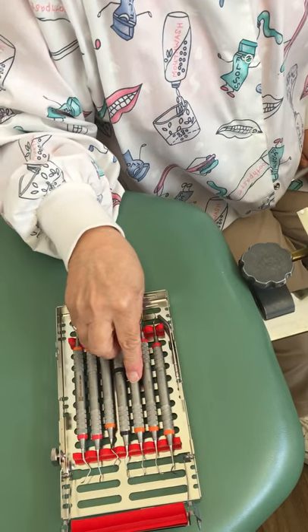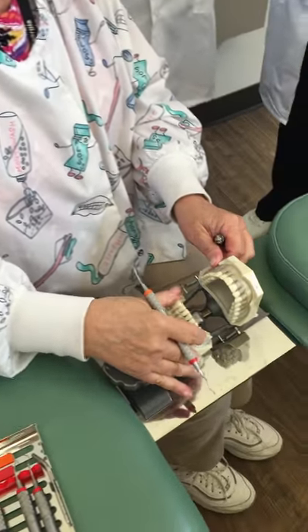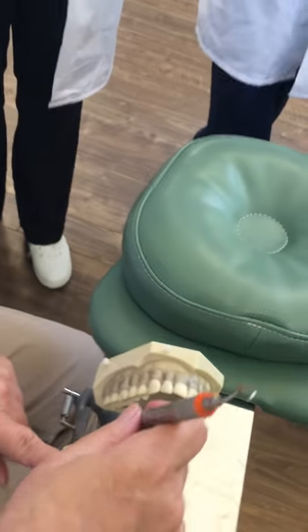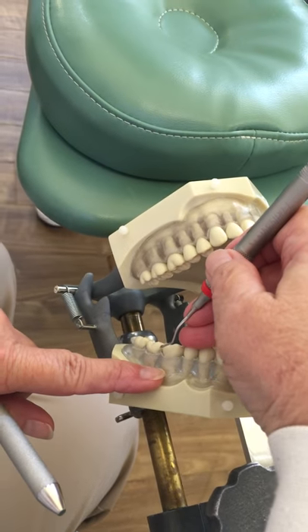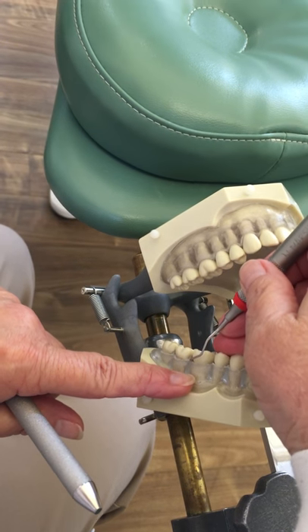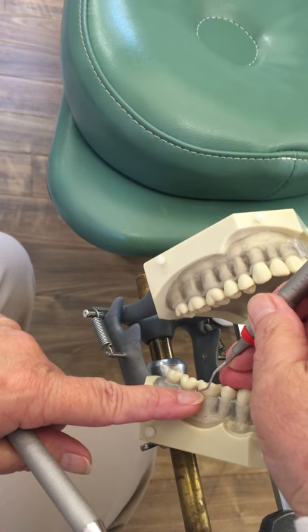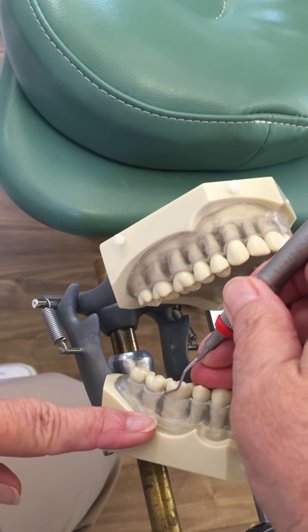The Gracie 1314 — remember, it's an area-specific instrument. It's used in the distal direction. So now we have to check for the right end. I'm going to put my fulcrum in first and check it on the distal, because this is a distal instrument. I'm going to look for the lower third of the shank, and it should be parallel with the long axis of the tooth.